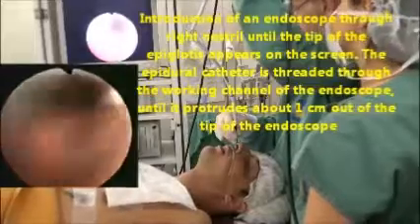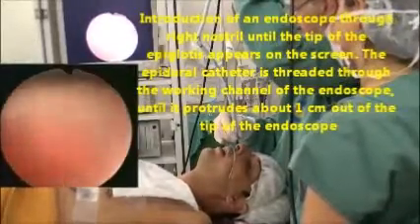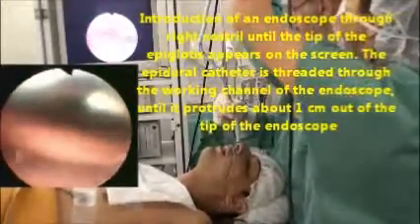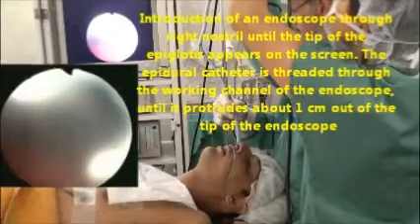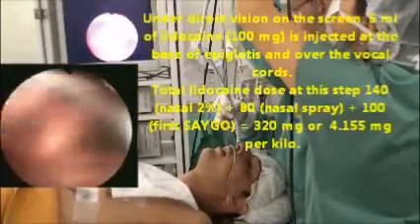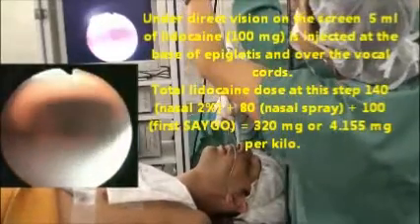We chose the scope-first technique for the sake of the movie. After getting lost with some pink outs, we eventually found the tip of the epiglottis and the vocal cords. We tried to maneuver the tip of the endoscope in order to put the epiglottis in the center of the screen.